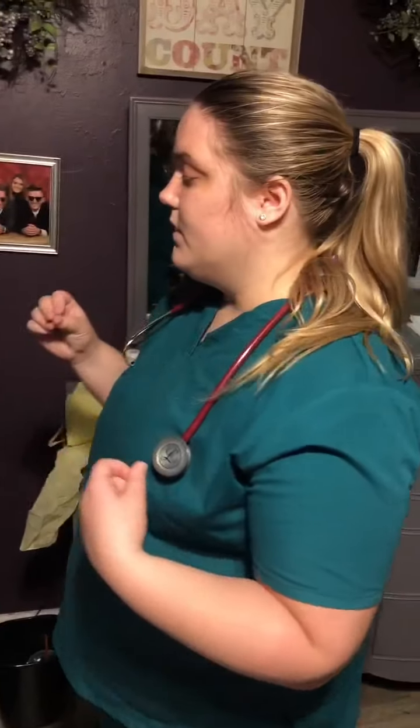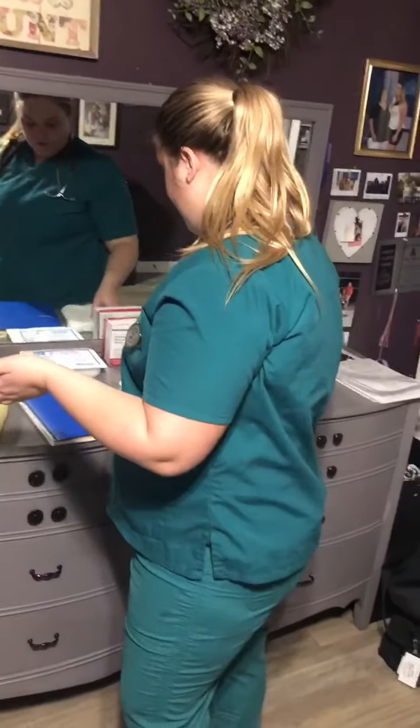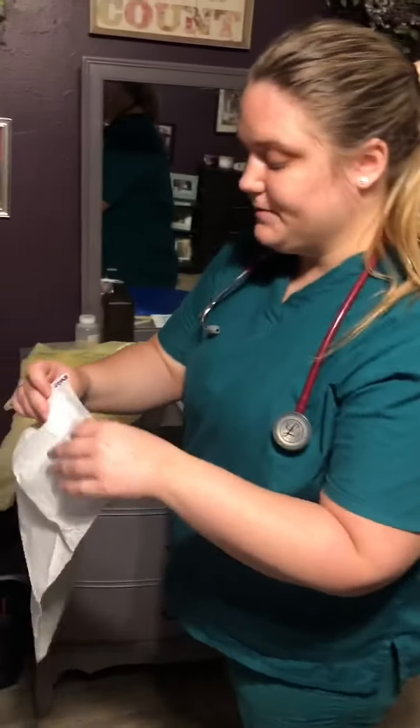And then I would assess their respiratory status. So are they having any difficulty breathing? I would auscultate lung sounds anteriorly and posteriorly in 6 places on both sides. I would check their pulse ox, their skin color, and the rhythm and the depth of their breathing, if they were in any distress, and that they were okay. So then, as I mentioned, I would administer the pain medication, document that. I would put my drape over my patient.